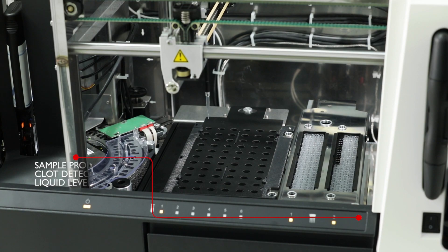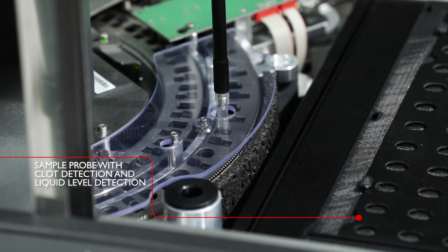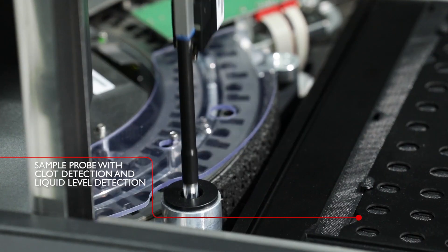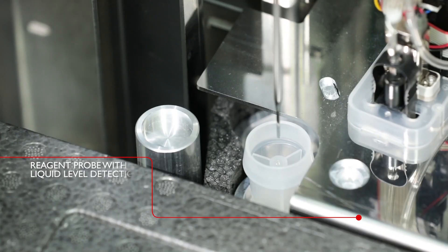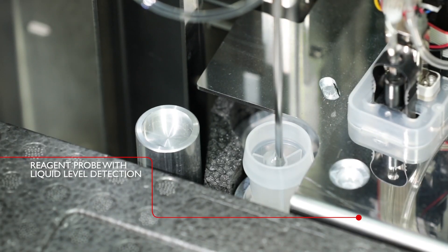A predefined volume of samples and reagents is pipetted into the cuvette. Disposable tips, active washing plus liquid level and clot detection all ensure accurate pipetting.